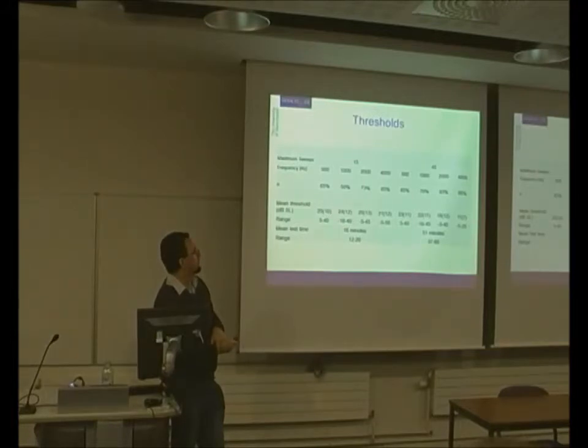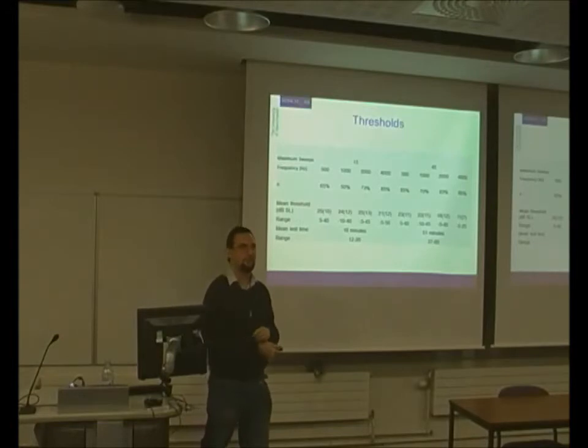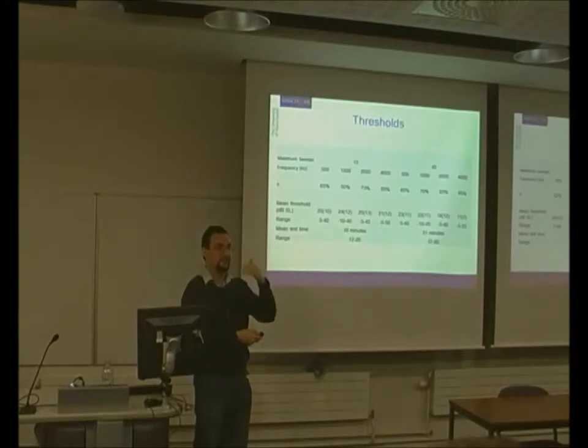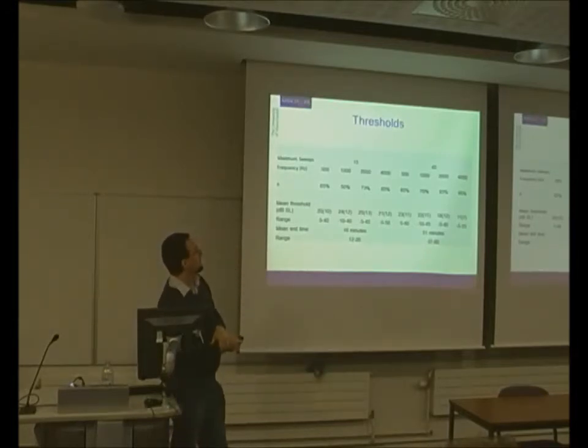So I also analysed what the recording time would have actually been. If all the responses in the recording were significant sooner, we could skip that and not require it running to the full 15 or the full 45. But if only one of the points in the recording weren't significant, we'd have to carry on until it was, or till the full test time. So that's how we get into recording times.